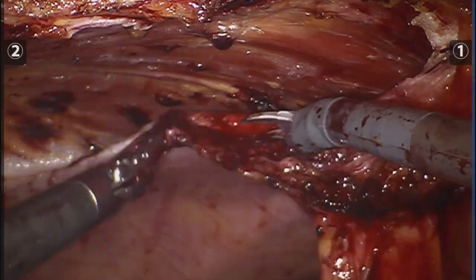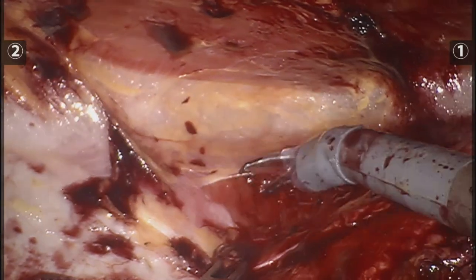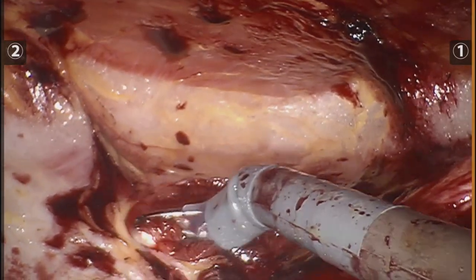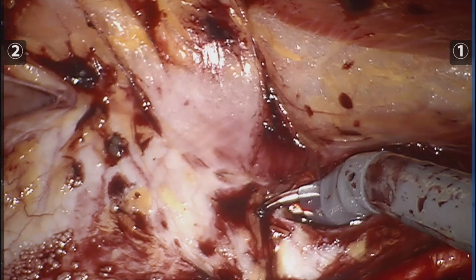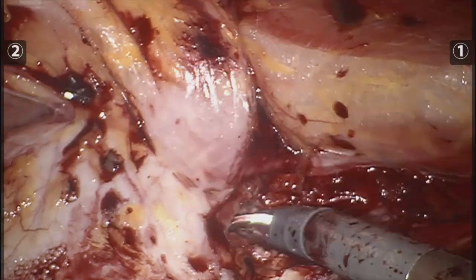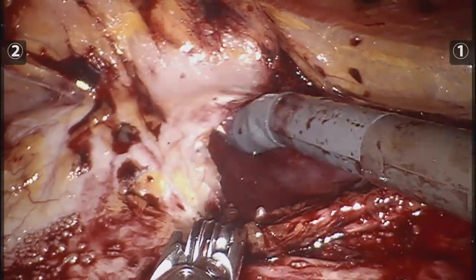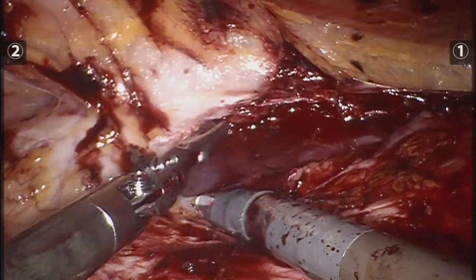I dissect a little bit more and once I locate my transversus abdominus muscle I make an incision on the posterior lamella, trying to stay close to the insertion of the transversus abdominus to reduce bleeding to a minimum — great advice given by Dr. Javier Curi during the procedure. As the space starts to become more evident I am able to dissect and feel more comfortable, but of course I had a few peritoneal incidentals.